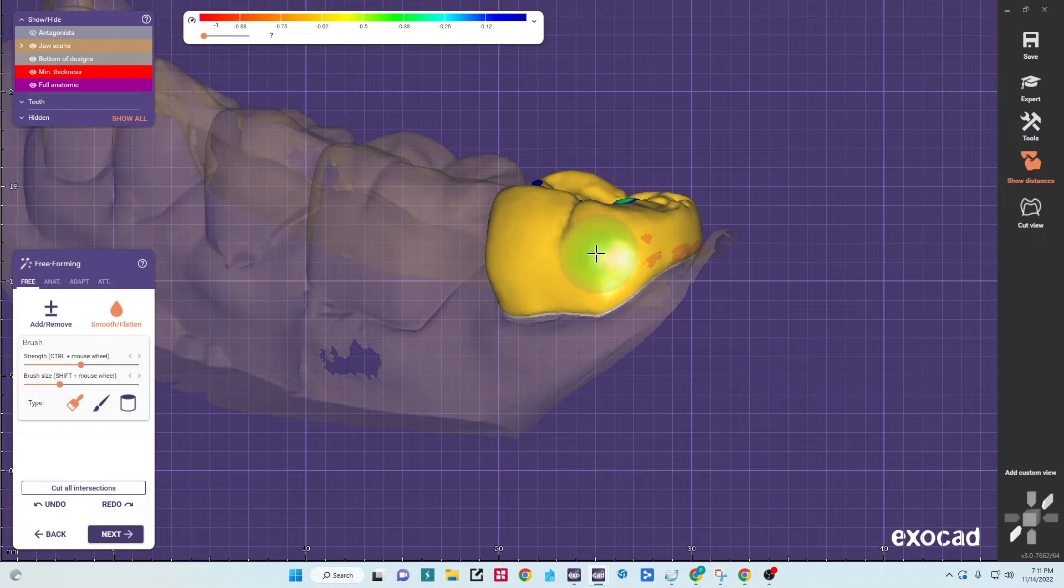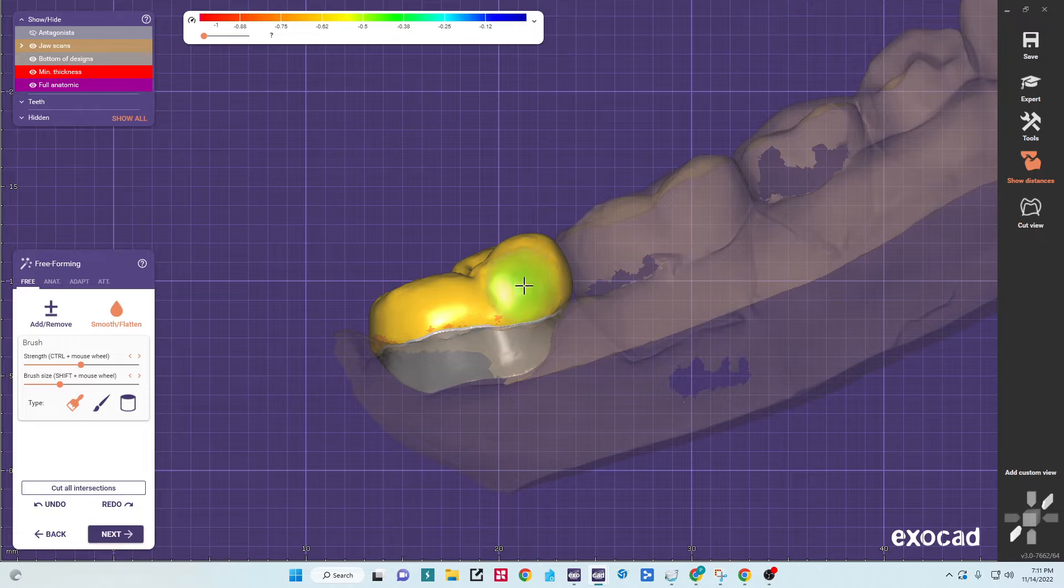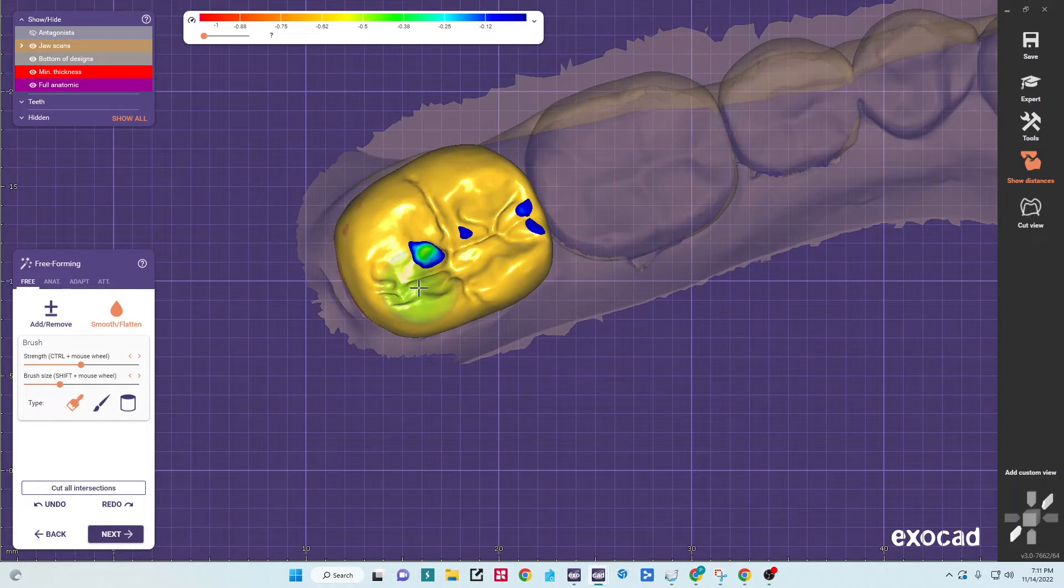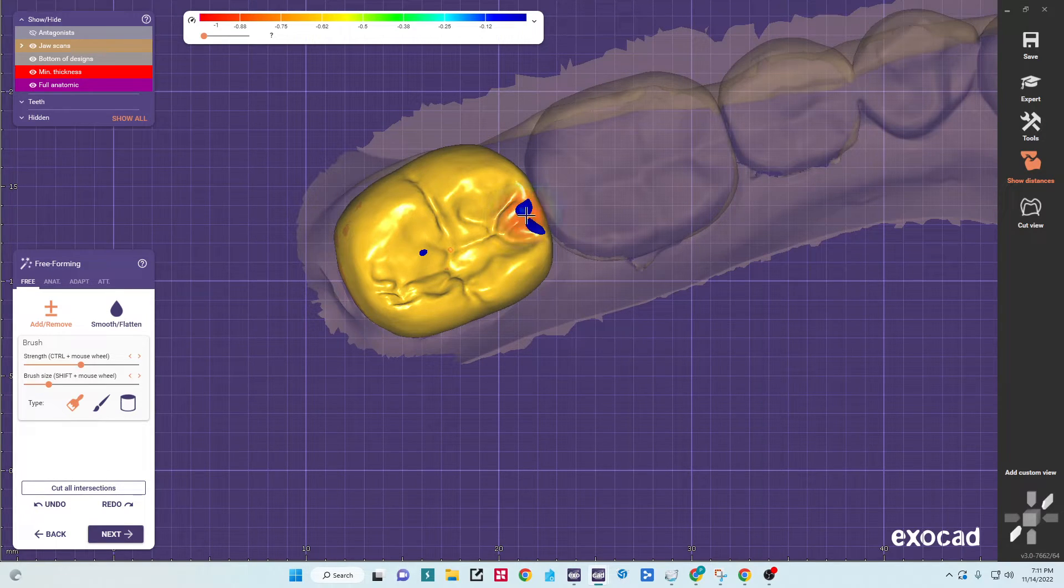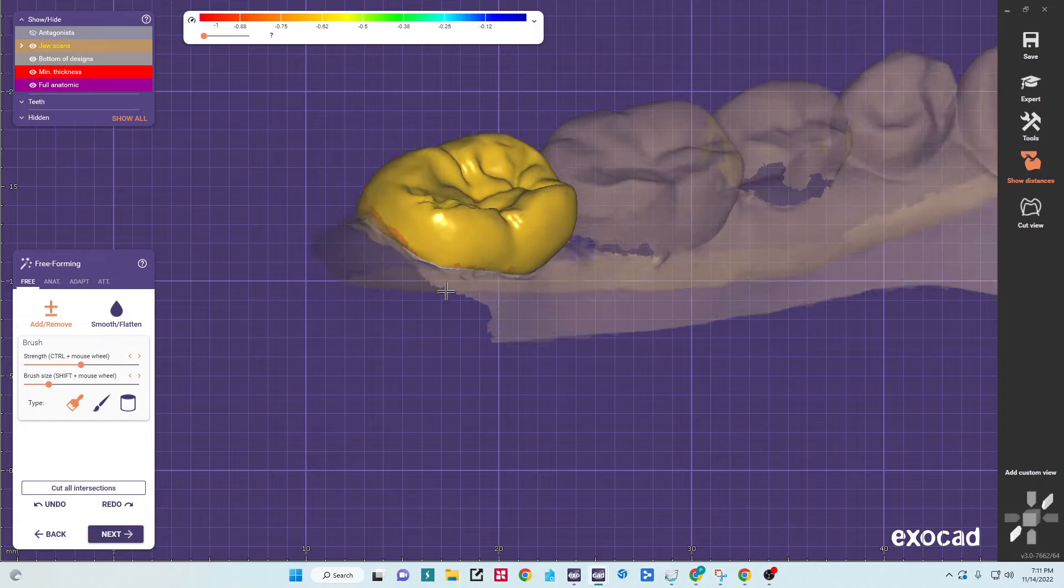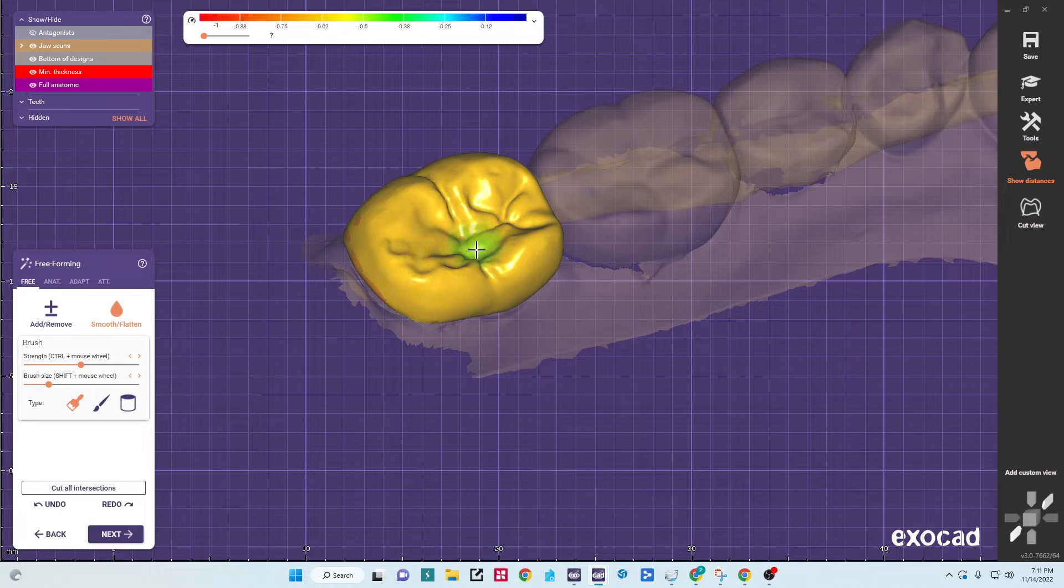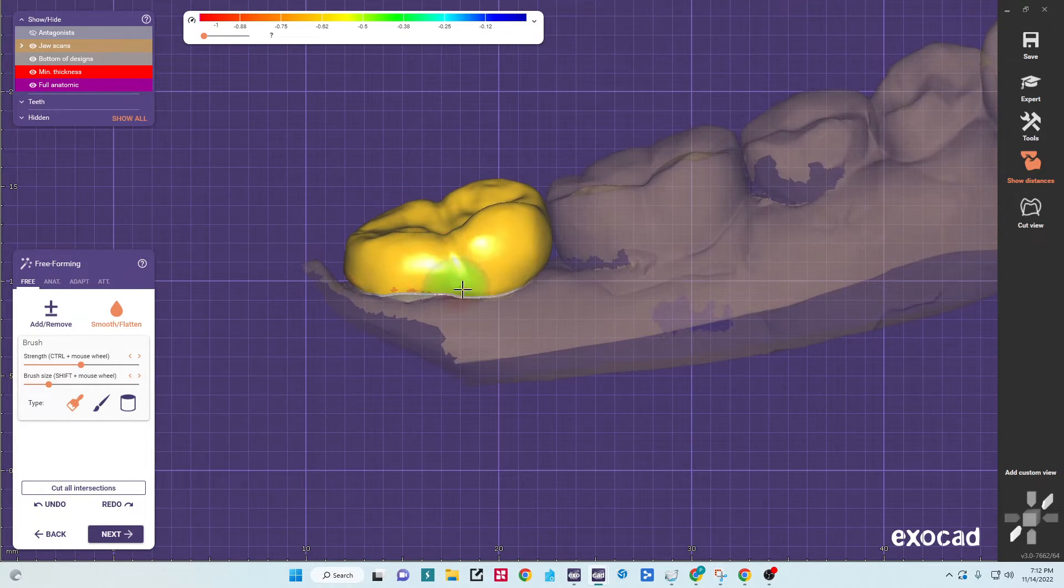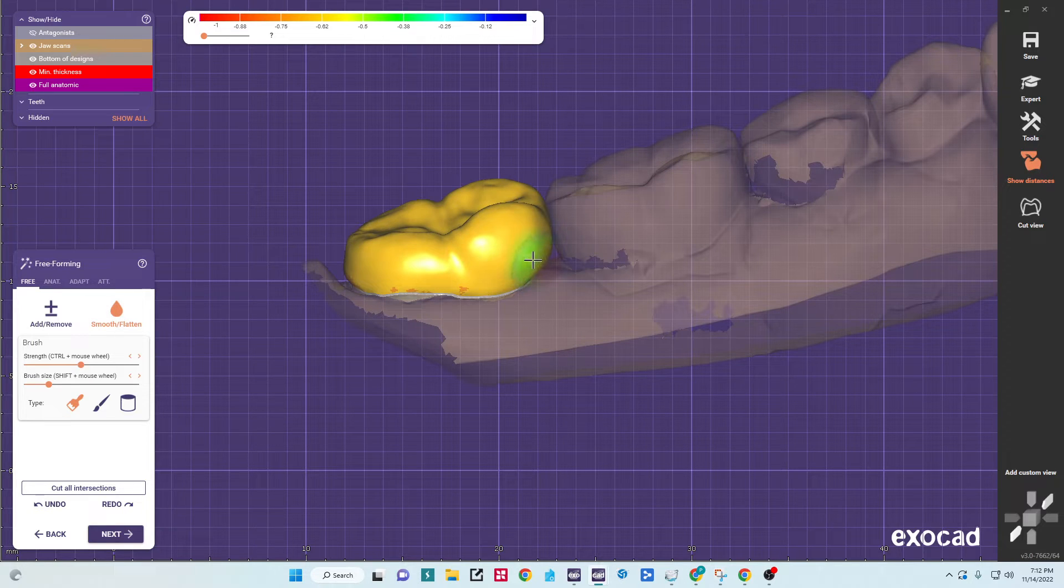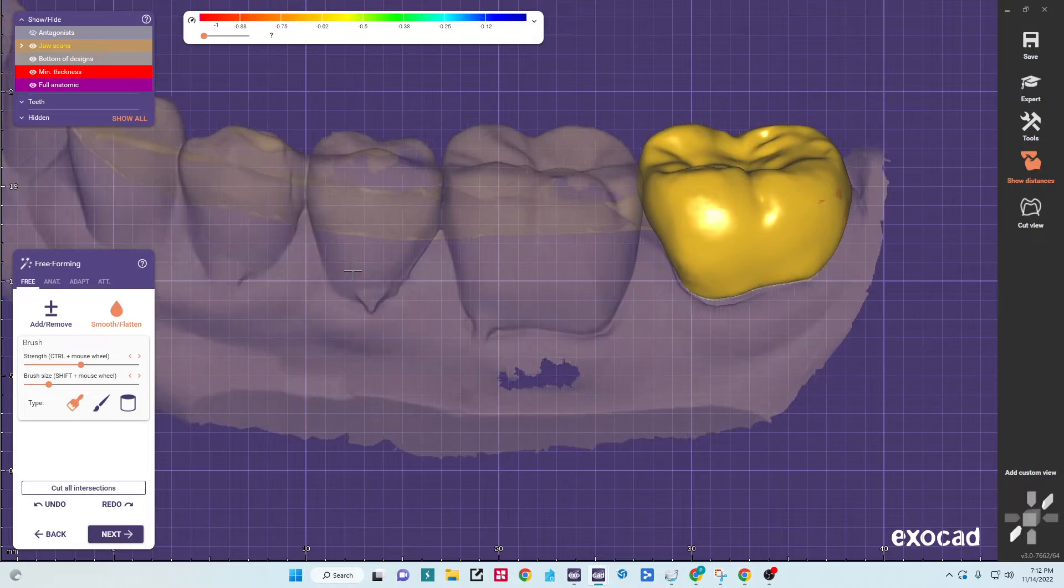And then the way this proposal comes in will often just look a little bulky by the margin. That red is our minimum thickness. And then I like to hit that, hold shift, hit the remove button just to fix our occlusion so we don't have any high spots. And then I'll smooth it because it comes in a little excessive on the anatomy for most patients.